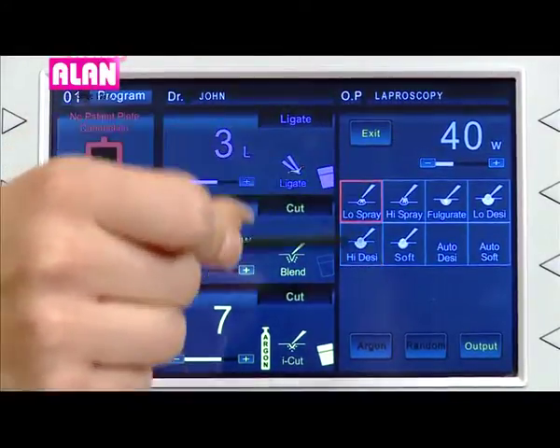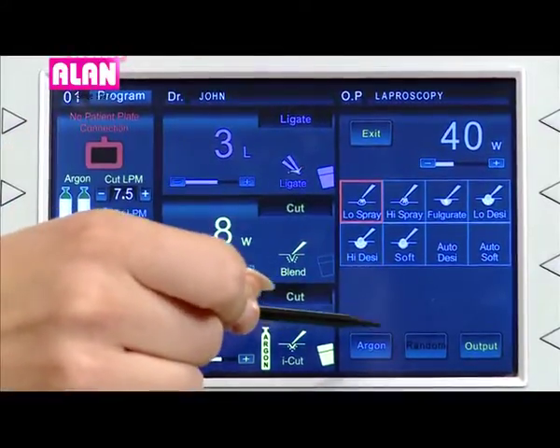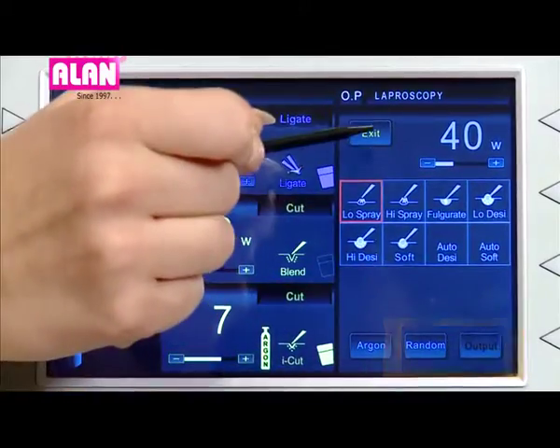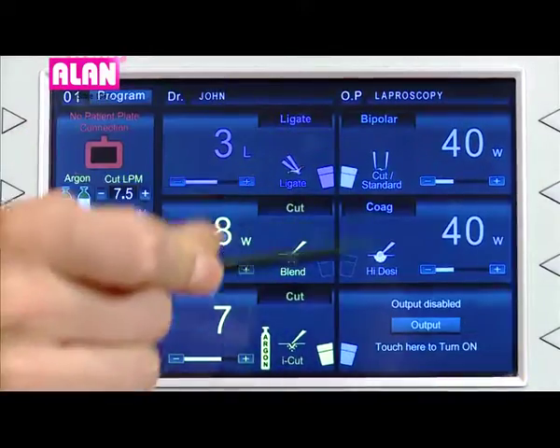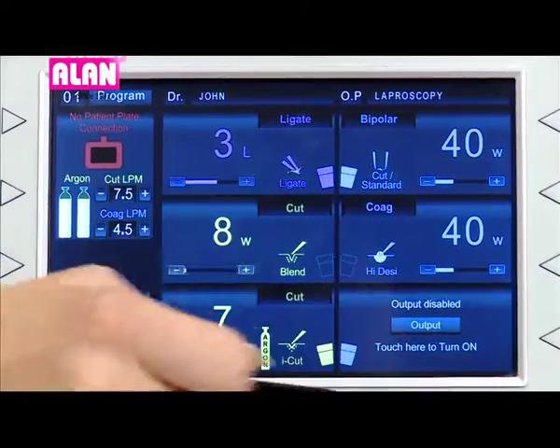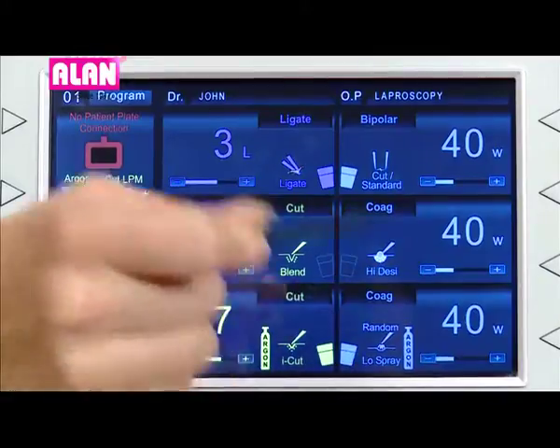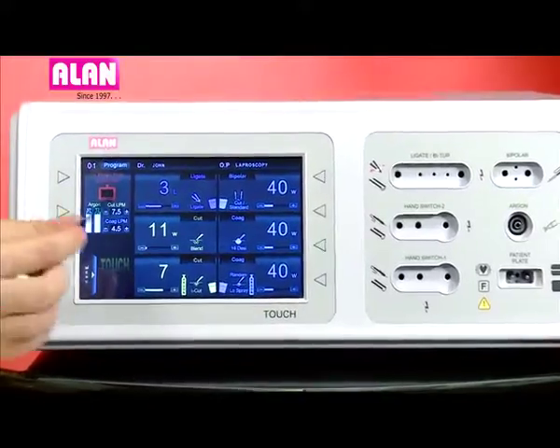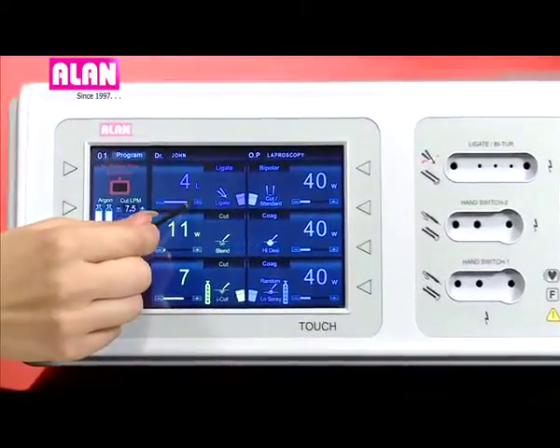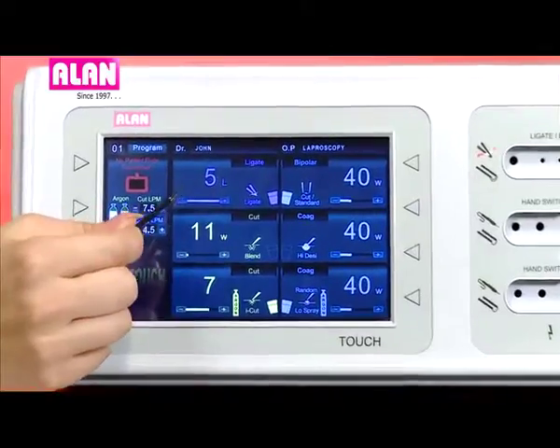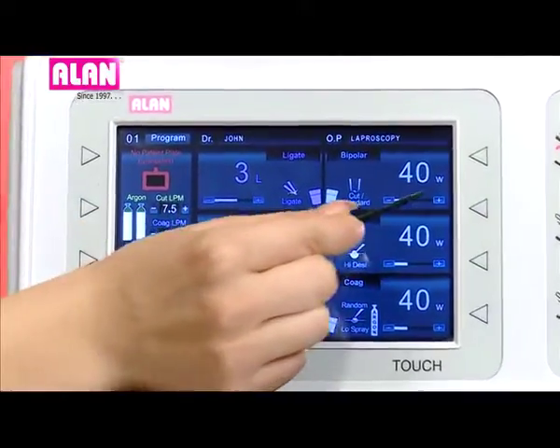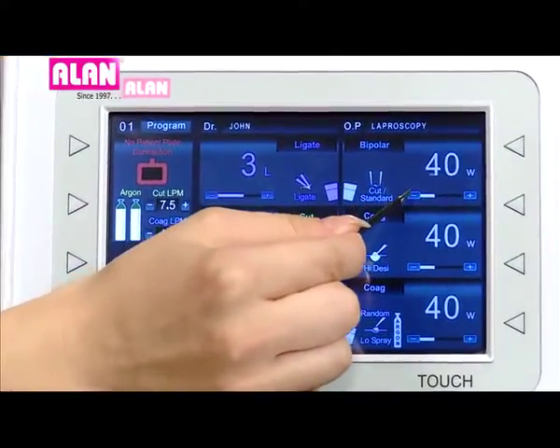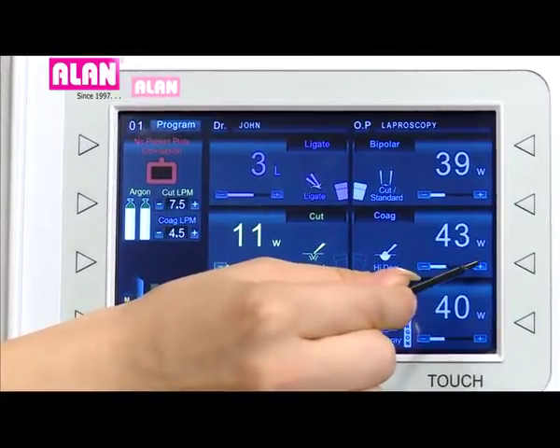Randomized spray can be selected by touching the random icon. Output power can be disabled by touching the output icon. The power levels can be varied without entering the submenus from the front panel itself.